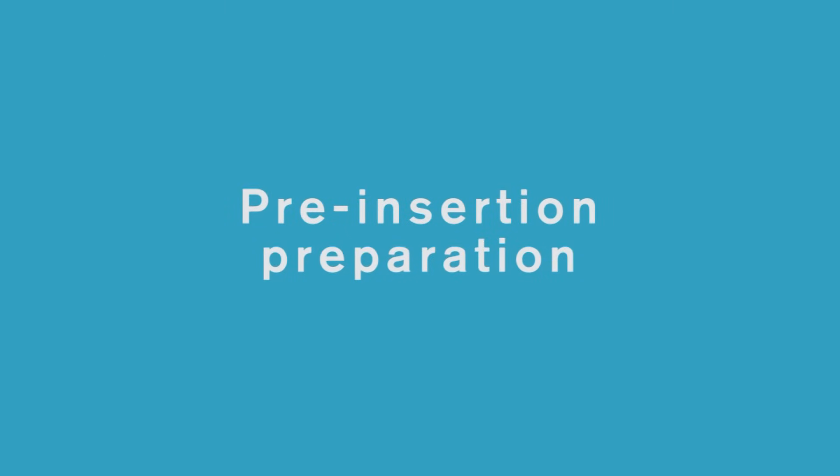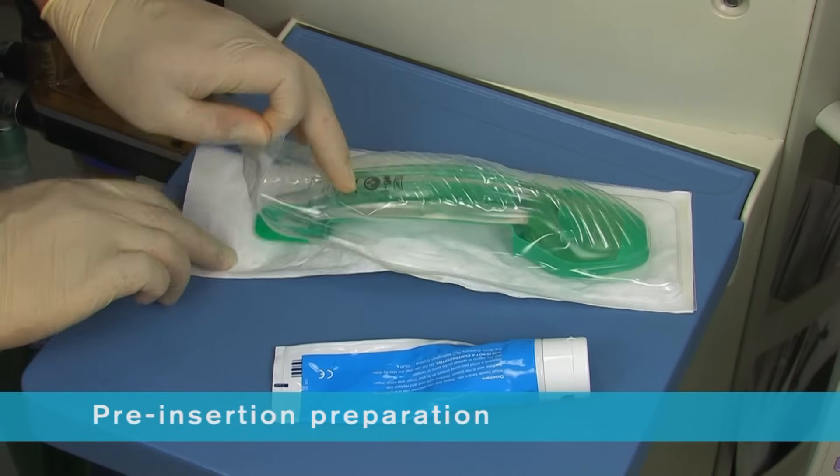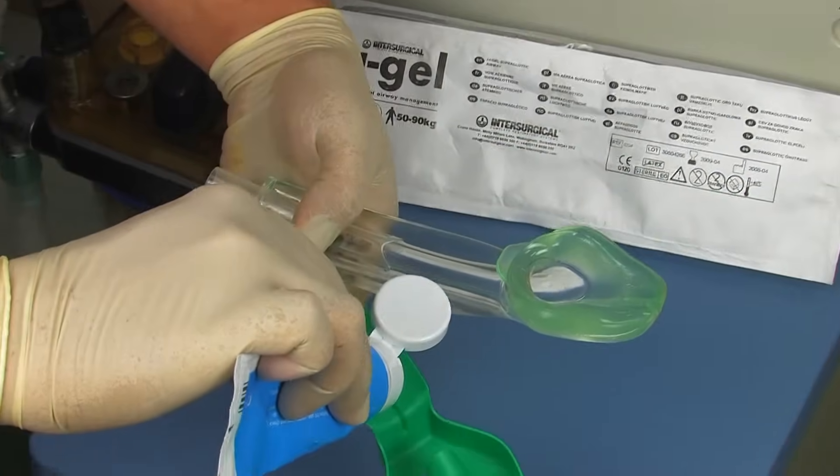Pre-insertion preparation: iGel is supplied in a sterile pouch enclosed in a protective cradle. This innovative packaging is colour coded for size and designed to ensure the device is maintained in the correct flexion prior to use. It also acts as a base for lubrication.